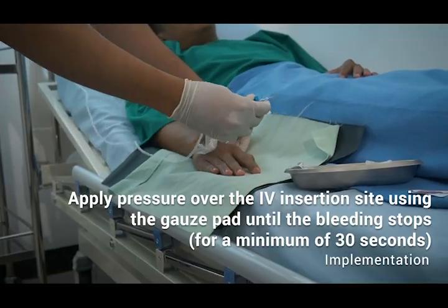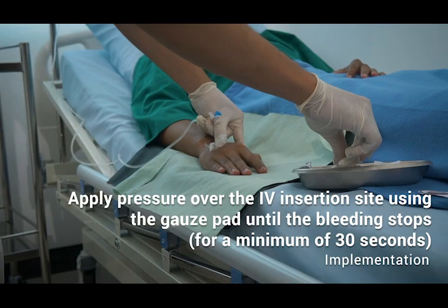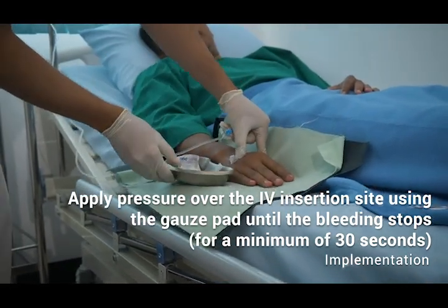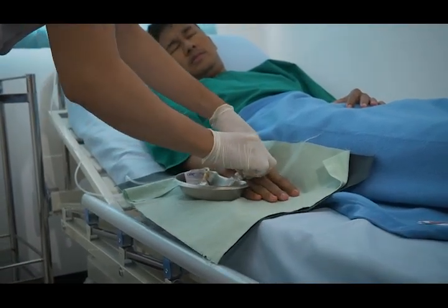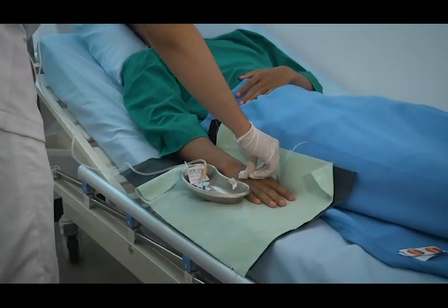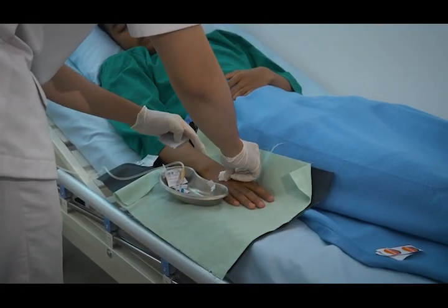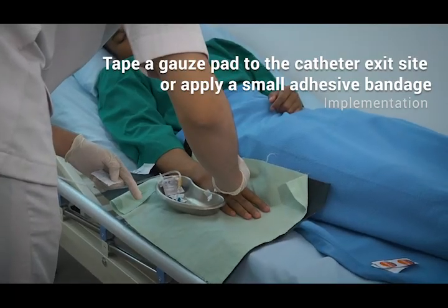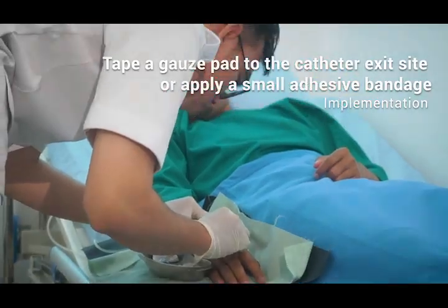Apply pressure over the IV insertion site using the gauze pad until the bleeding stops, for a minimum of 30 seconds. Tape a gauze pad to the catheter exit site or apply a small adhesive bandage.